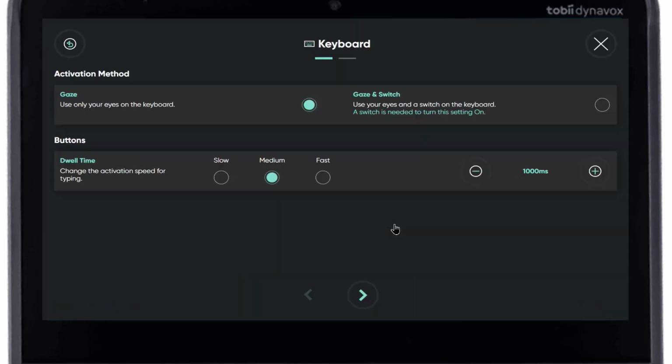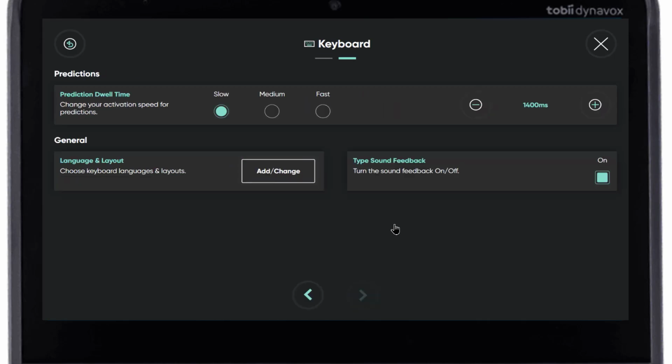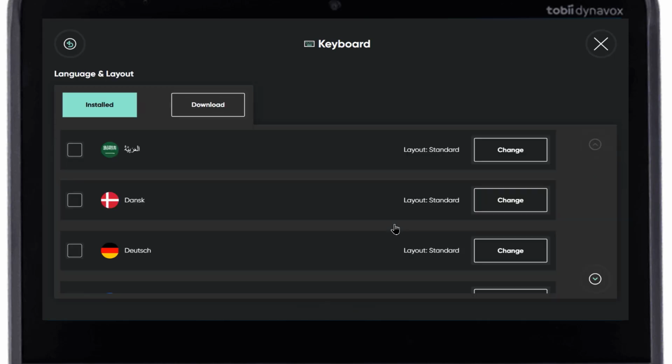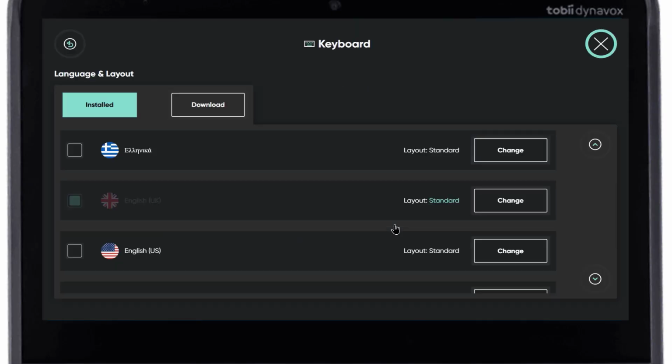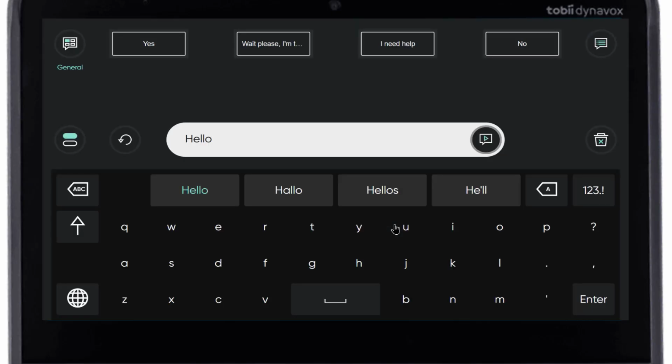And this is the other route that you can make the change as well, through the actual full settings within the keyboard group. I think it's actually quicker to go through the globe symbol on your keyboard. So just change it back to QWERTY now.